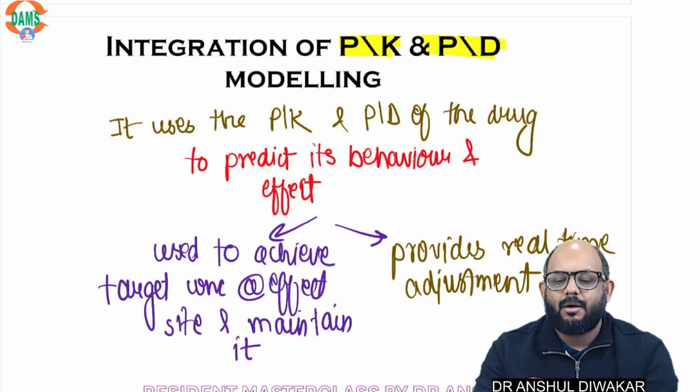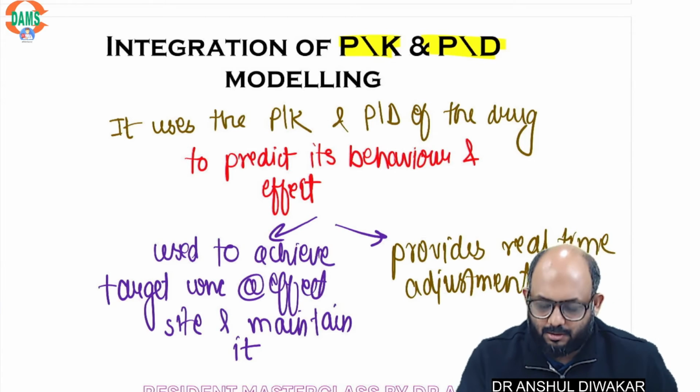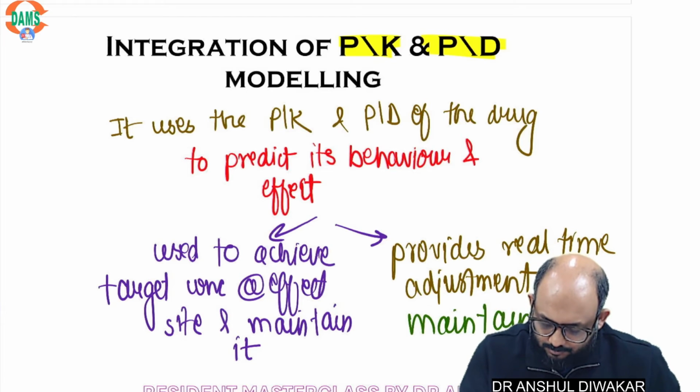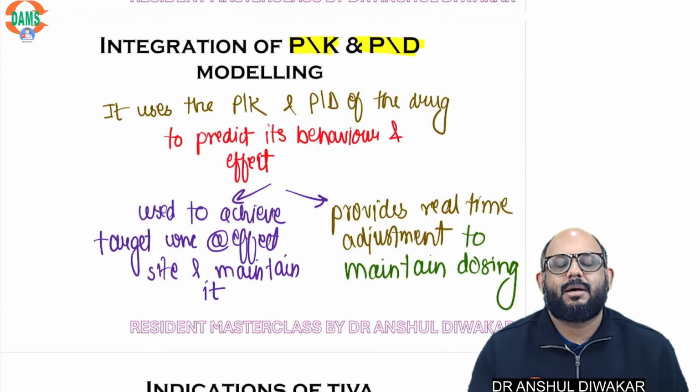It provides real-time adjustments to maintain the dosing according to your target.